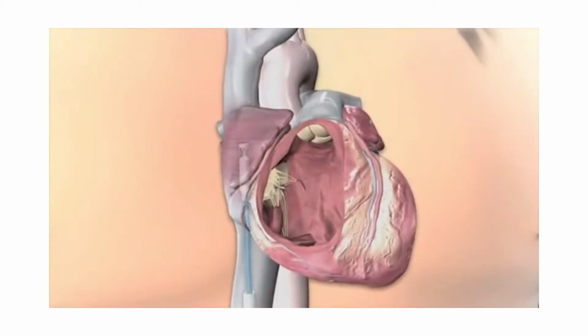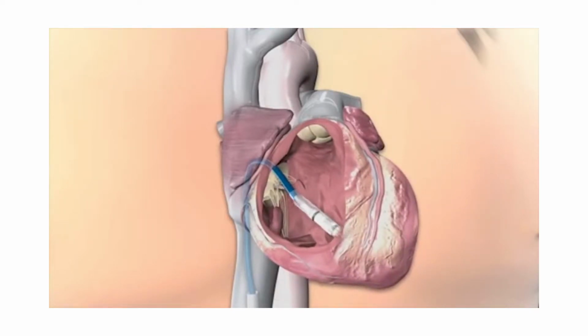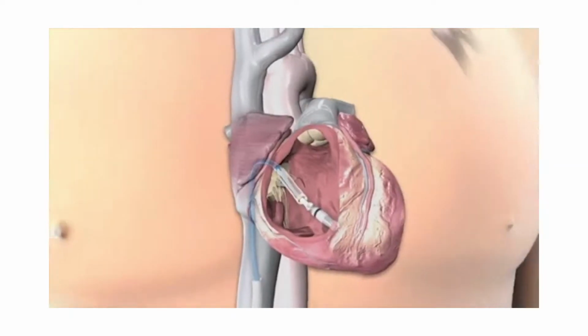It's this tiny device about the size of a nickel that we can implant directly into the heart, again from the veins in the leg, and it serves to treat patients who are chronically in atrial fibrillation and just need the lower chamber of the heart to be paced, and it's a way for them to be treated without having any type of surgical procedure or generator. So very promising from that perspective.